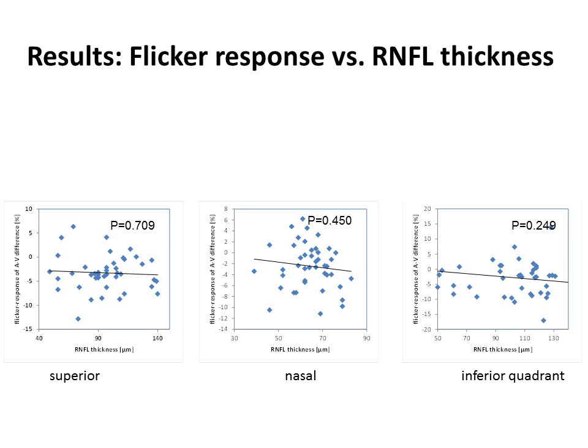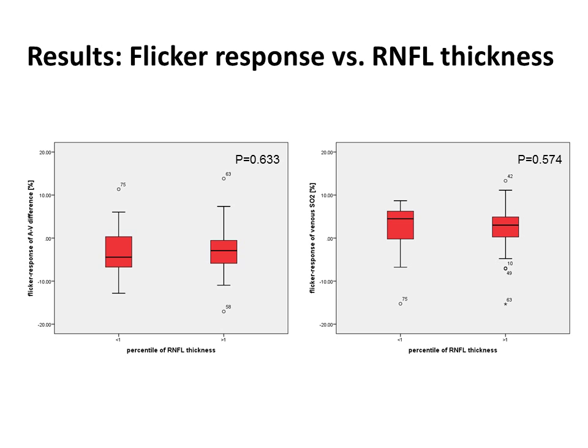And even if we looked at only the retinal quadrants with nerve fiber layer below the first percentile of the normative data of the OCT device, and compared that with the rest of the retinal quadrants, there was no significant difference. So we have to question this hypothesis that the dropout of neurons is responsible for these findings in oxygen saturation.